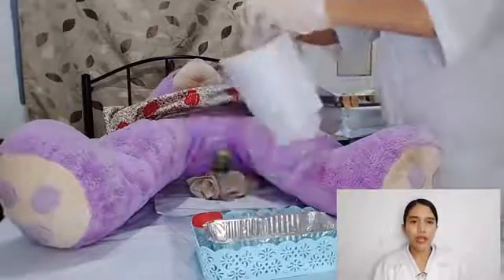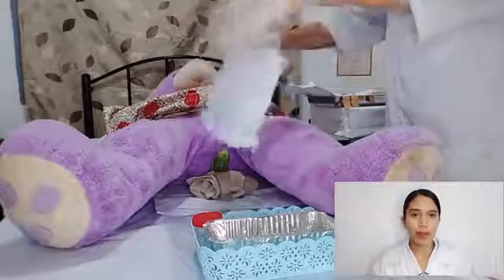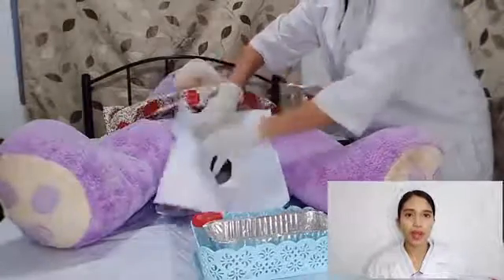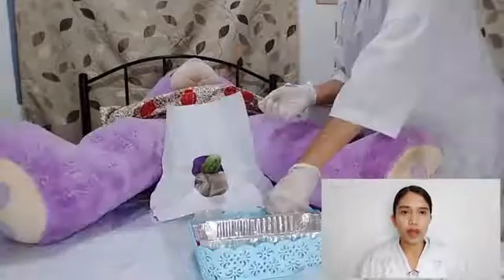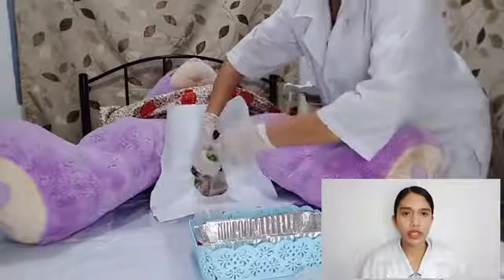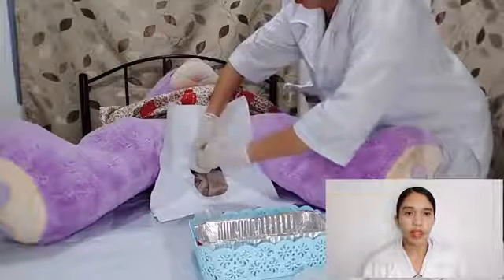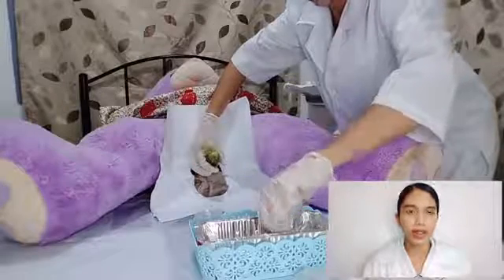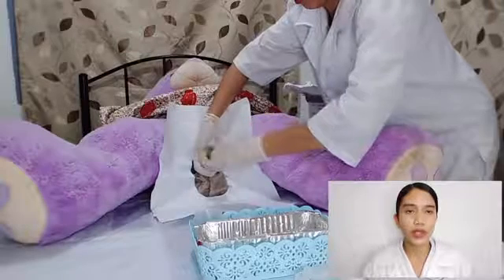Grasp the upper corners of the fenestrated or eye drapes and unfold it. Place the fenestrated drape aseptically over the perineal area with the penis extending through the opening. A drape provides a sterile field where the equipment and the hands will be placed. Holding the penis with a non-dominant hand, disinfect the meatus twice using cotton balls with betadine aseptic solution. Starting from the top, use a circular motion stroke, then downward for each cotton ball and discard. This cleans the area and minimizes the risk of urinary tract infection by removing surface pathogens.